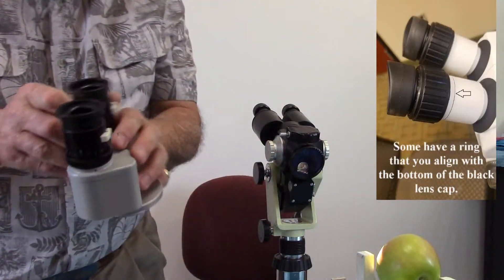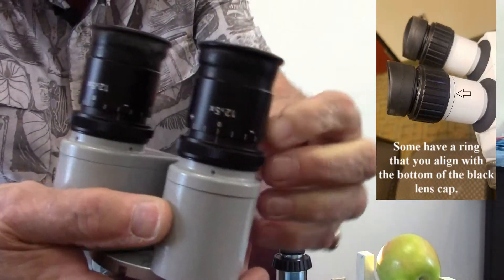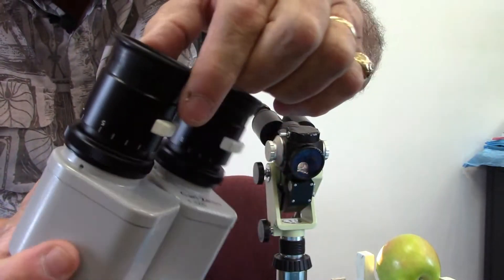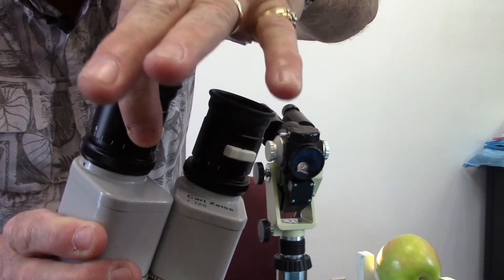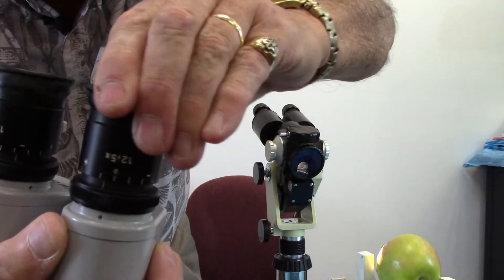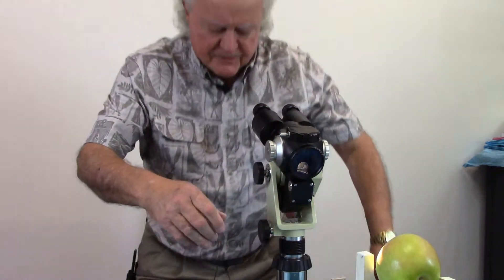On some scopes, there's a little push lever on the side of the ocular. On one like this, you have to push that lever in — that unlocks it — so when you push it in, you can twist it. But when you lift your finger up, it doesn't move anymore; it's locked in place.